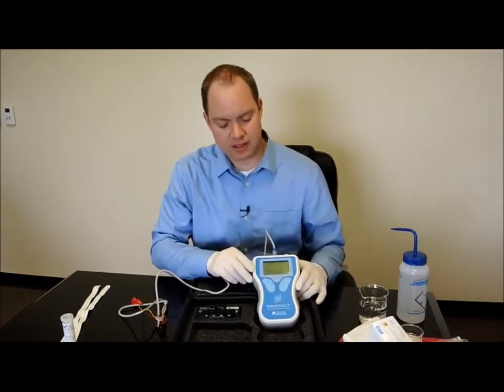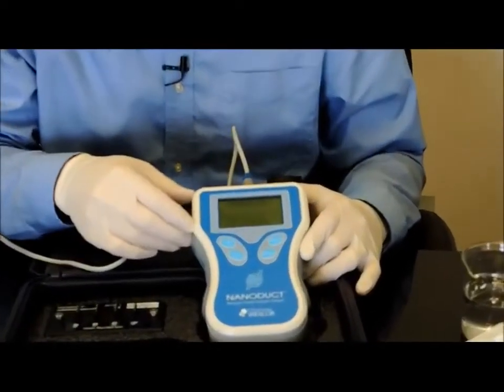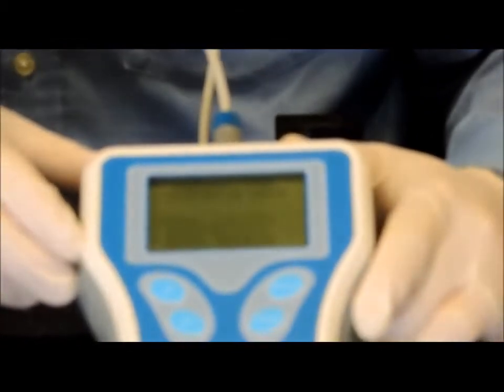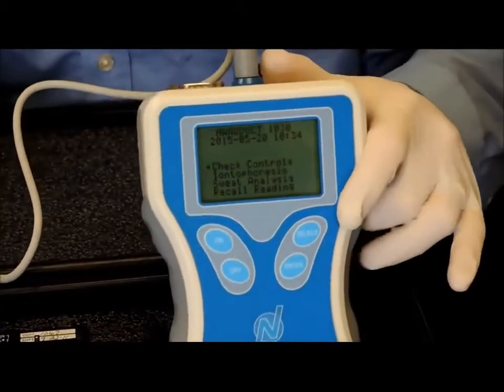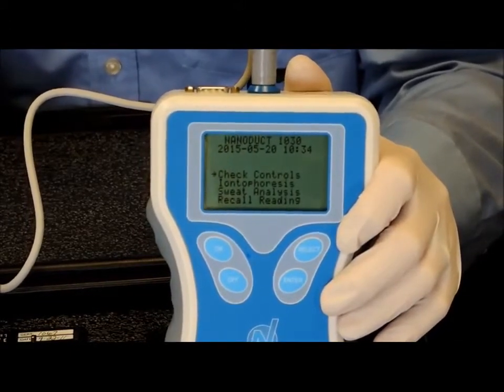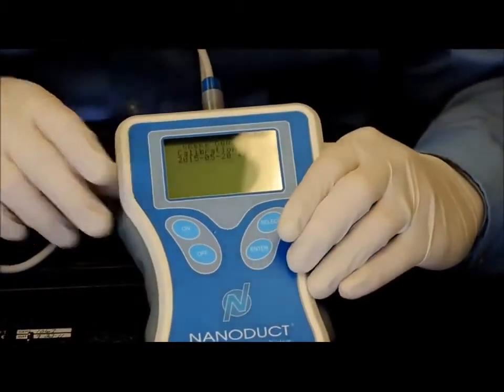With the cable connected and the Nanoduct turned on, you'll see an arrow pointed towards check controls. You also see the date and time listed on the top part of the screen. The check controls should be run every day. That's used by plugging in the electrode cable, the sensor cell portion of the electrode cable, onto the calibration plate. You should only do electronic calibration and never do liquid calibration. So I'll press enter to go into the check controls portion.